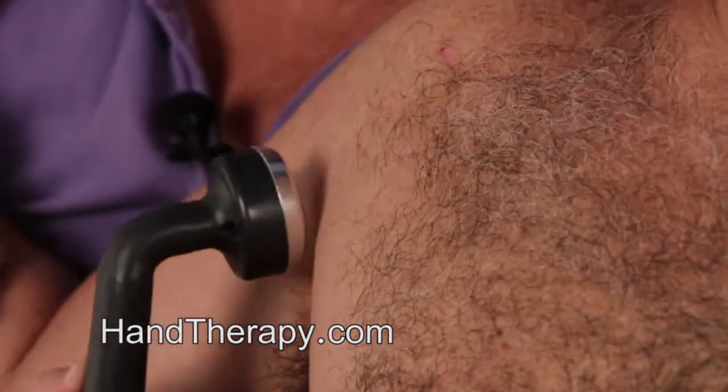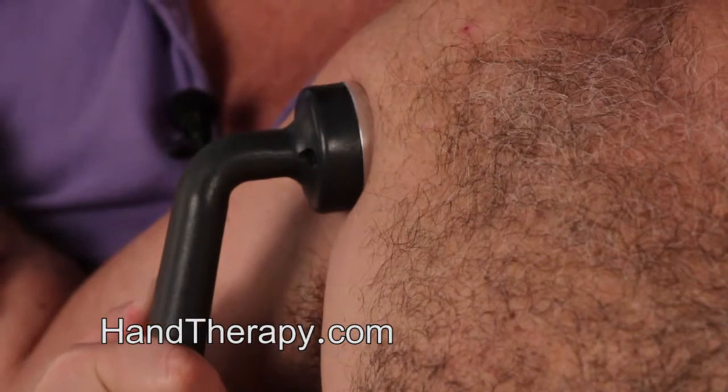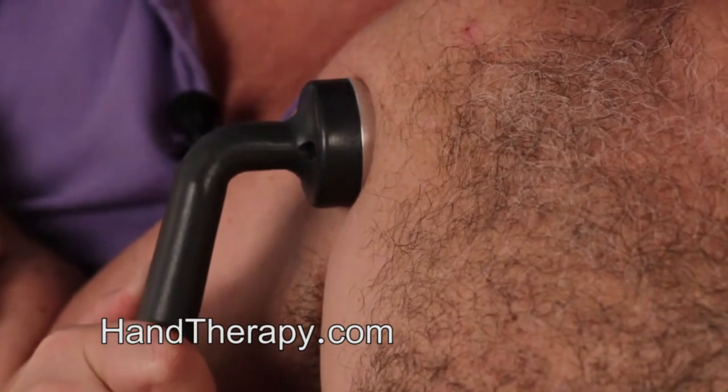Now, if somebody has adhesive capsulitis, what position do you want? You want maximum abduction and external rotation. So I'm going to bring my patient's arm into abduction and maximum external rotation and apply the ultrasound head right here. This will give the maximum tissue exposure.